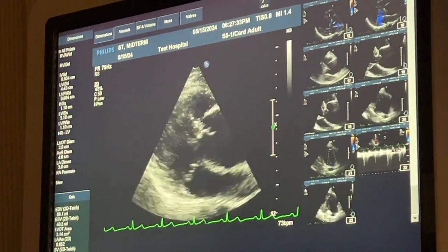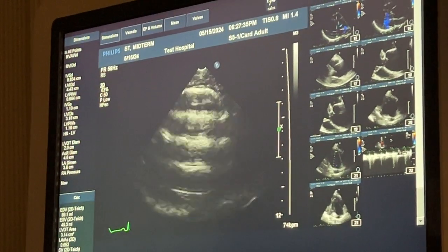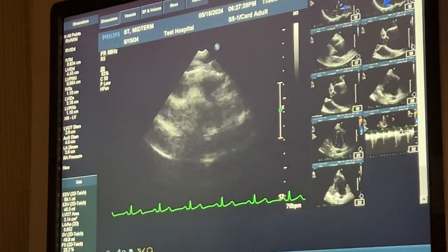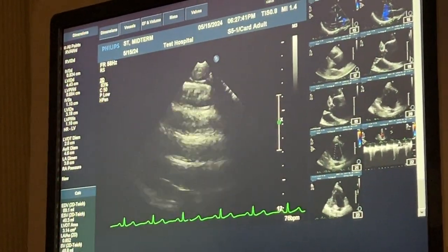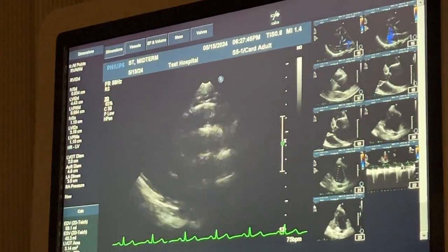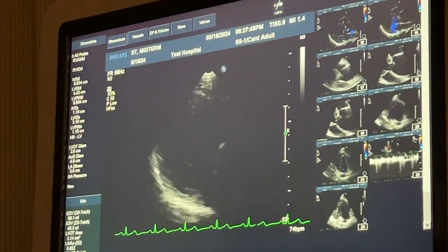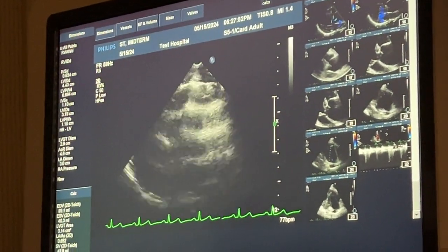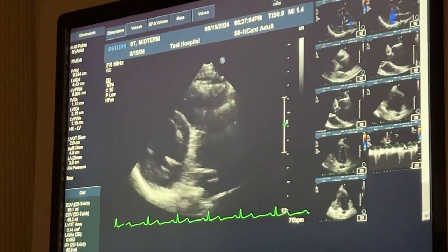Okay, now I'm going to pass back through regular old standard parasternal, and then I'm going to go for that RVOT view. I'd say on most patients, it's really quite hard. I will say you guys have really nice views. And especially on people who have had surgery before, it is so hard to see.